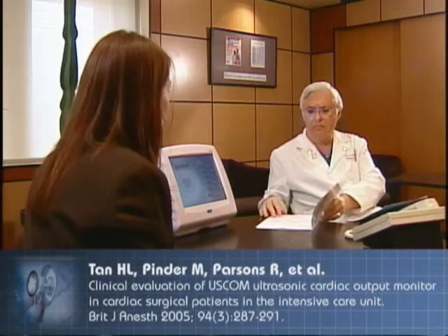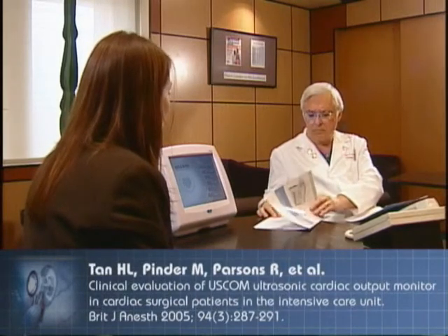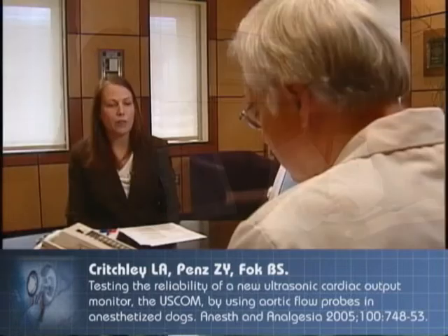Do you have any studies on accuracy? Has the device been validated? Yes, we have 2 published validation studies comparing the device with PA catheters and another one comparing the USCOM with flow probes in dogs. They all show very nice correlations. The device has also been compared with the CardioWest total artificial heart, and some of the original work was done in artificial circulation.